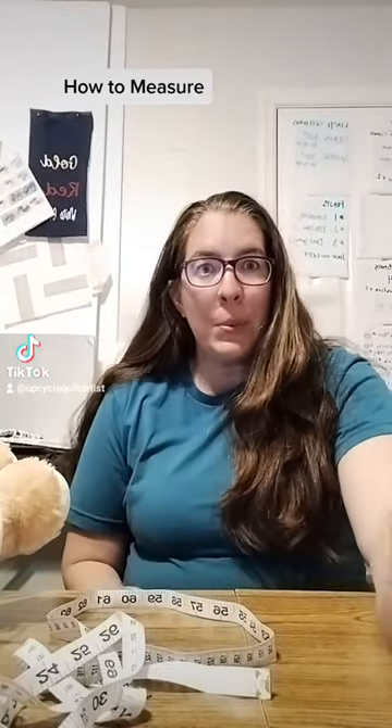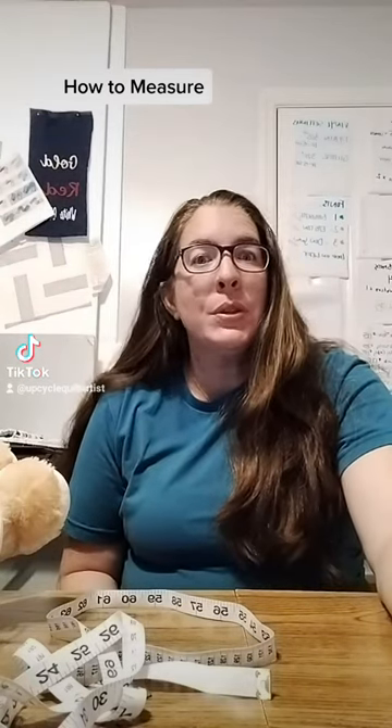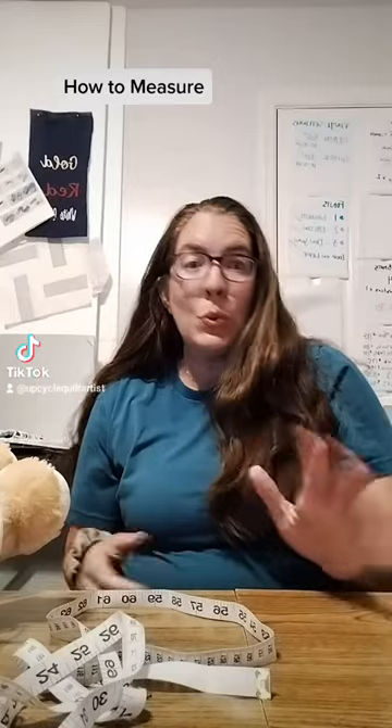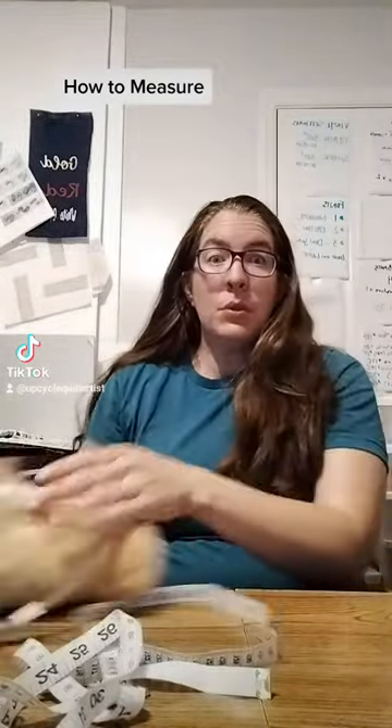Hello! So you're all ready to get a belly band and then you realize you have to get a measurement. And how in the world do I measure? This is really, really easy. People try to make it a lot more complicated than it really is. I'm going to use good ol' Barry here.